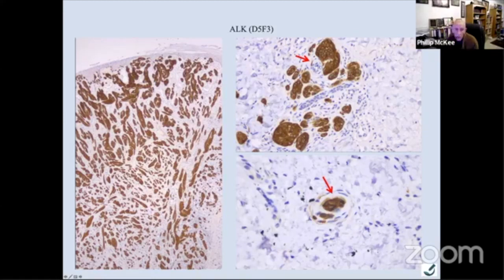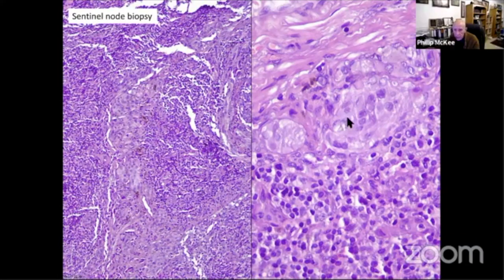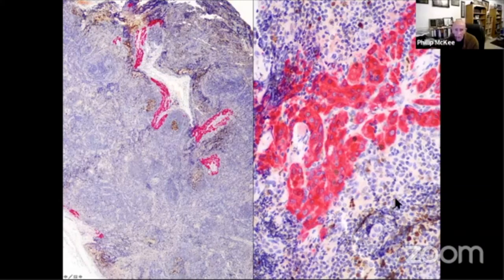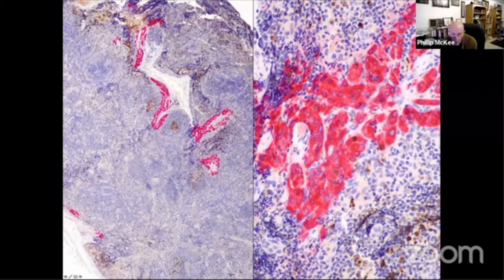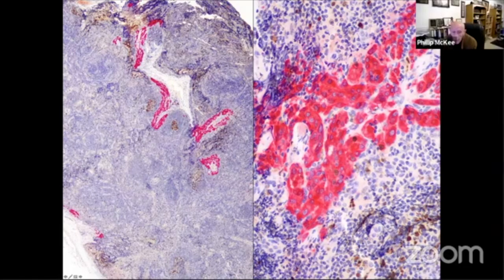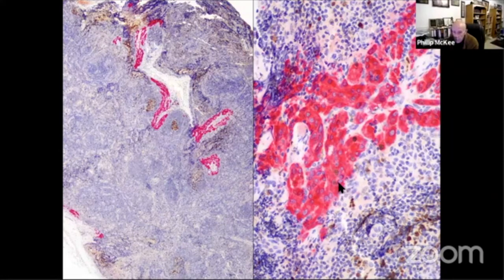Matthias asked for a sentinel node biopsy, and on H&E you can see there is conspicuous tumor present in that lymph node. This is Melan-A with tyrosinase, and Ki-67 expression — occasional nuclei are positive. I don't think we have any further follow-up, so I don't know what happened to this patient. But from the literature it would seem likely that this should be all that would happen to the patient, in that ALK1 expressing melanocytomas certainly can extend to the sentinel lymph node, but the biological behavior is generally believed to be good.